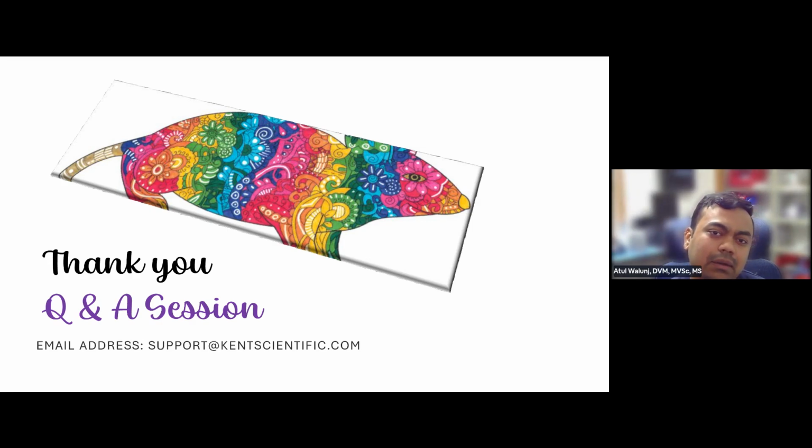But we do require that whatever in-between material is used, like a plastic material or a surgical drape, should be as thin as possible to make sure that the animal receives adequate warming at the same time.